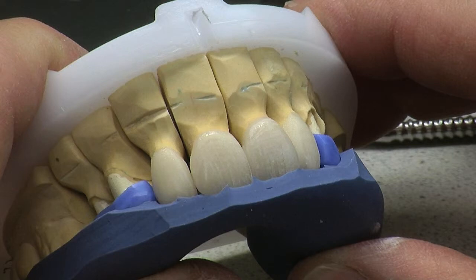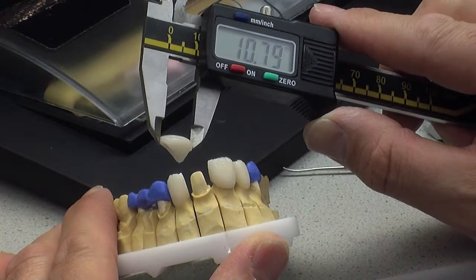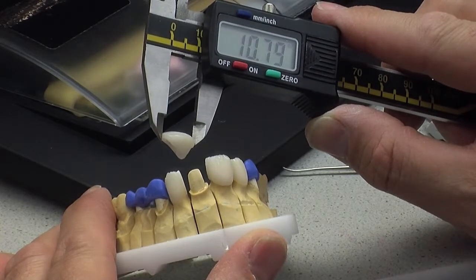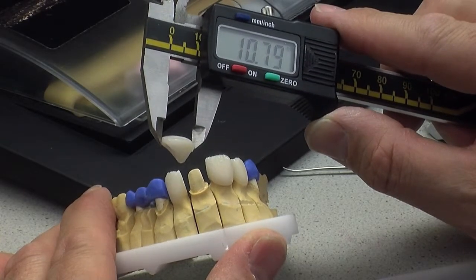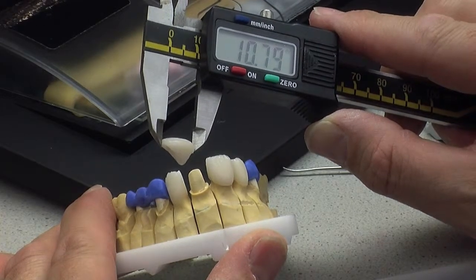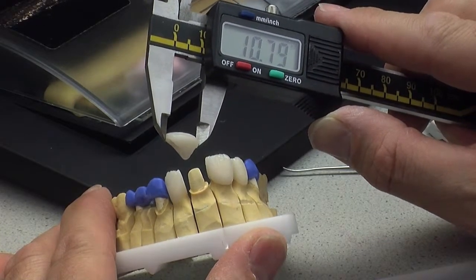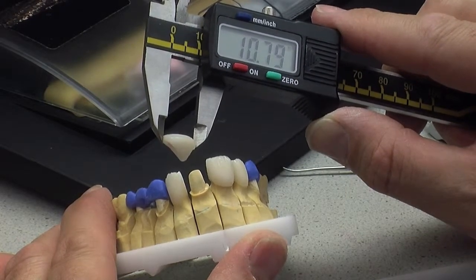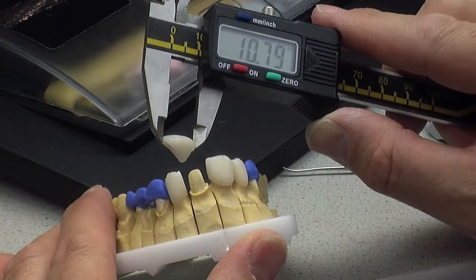I've still got a lot of trimming to do, but I'm really pleased as a first build up — it looks really nice. My prescription from the dentist was my upper left central is 10.64 on the digital callipers. My first build is 10.79. I'm only literally 0.1 out, and allowing for shrinkage on my subsequent firings plus my glaze, I'm probably going to be dead on 10.64. Amazing accuracy.